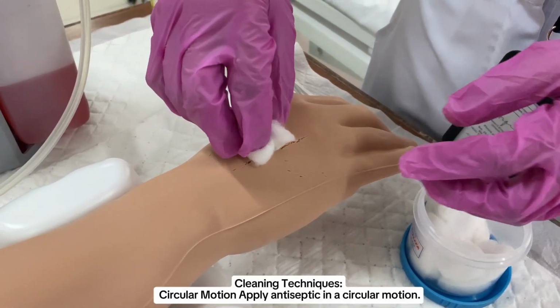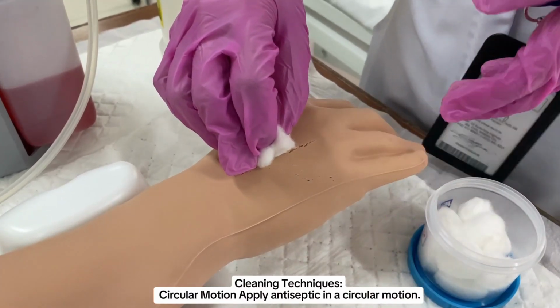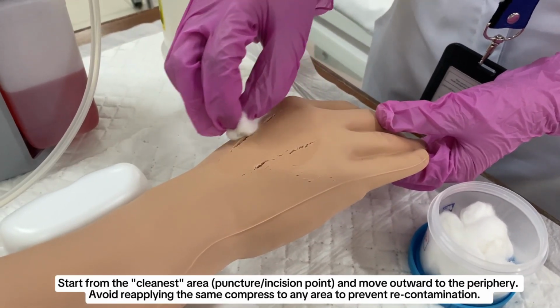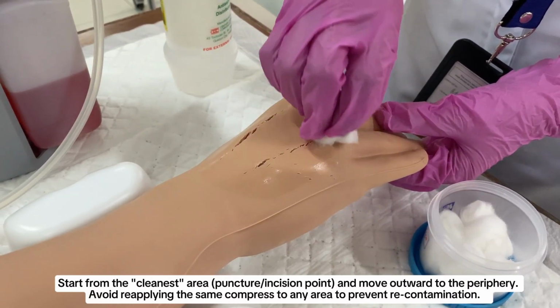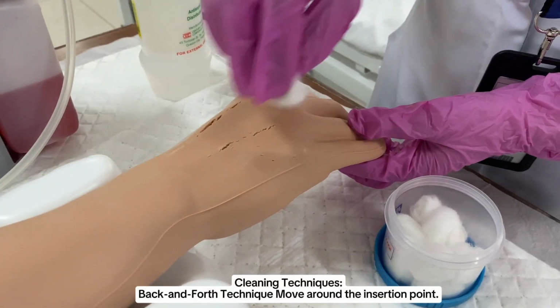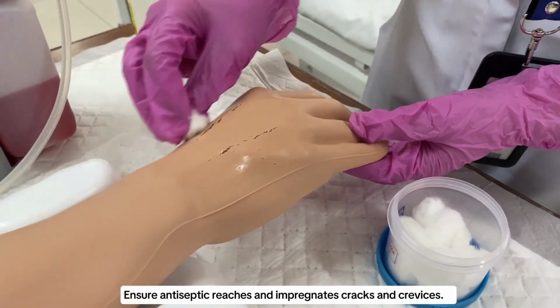These are the cleaning techniques. In the circular motion method, apply antiseptic in a circular motion. Start from the cleanest area, which is the puncture incision point, and move outward to the periphery. Avoid reapplying the same compress to any area to prevent recontamination. While in the back and forth technique, move around the insertion point and impregnates cracks and crevices.